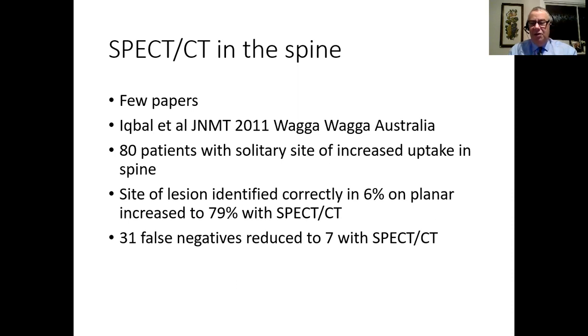And then there were 31 false negatives on patients with planar imaging, but only 7 with SPECT-CT. So they showed that SPECT-CT really was very useful in looking at spinal conditions.